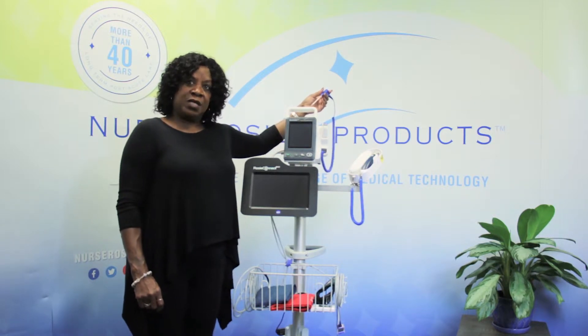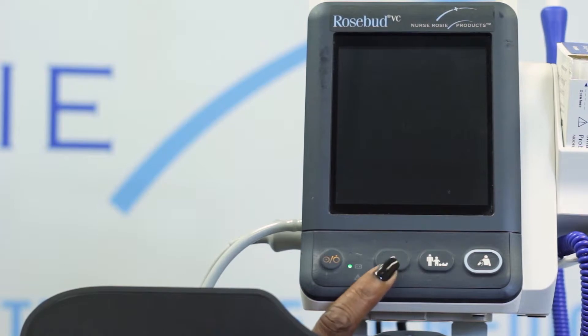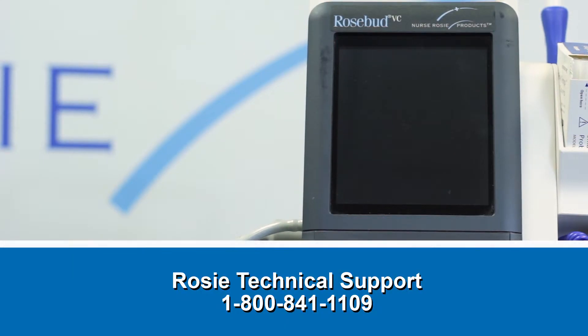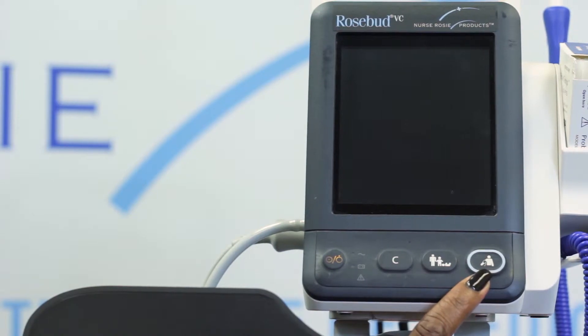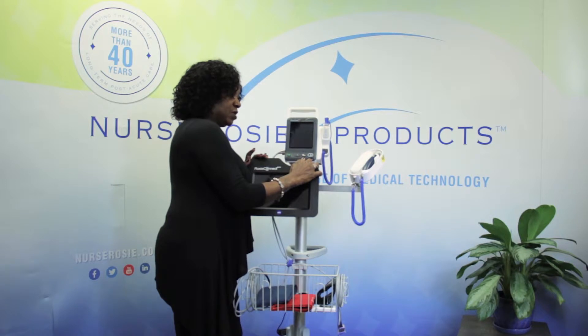Let me tell you about the other buttons on the monitor. The button labeled C is one you must press after taking each resident's vitals to clear their data. Next is another button which we don't want to use — if you do hit it by mistake, just give us a quick call at Nurse Rosy support and we will walk you through a quick fix. Finally, the last button starts the blood pressure cuff. Now let's pause so that you can turn on your vital signs monitor as well.